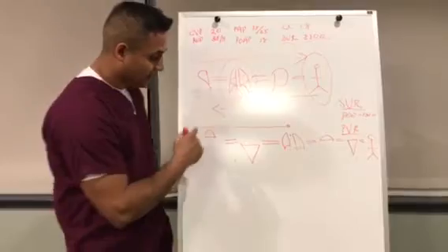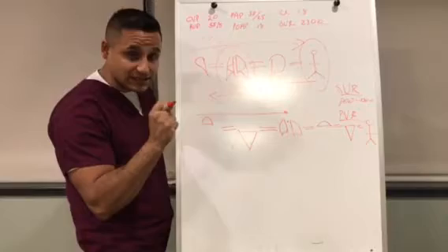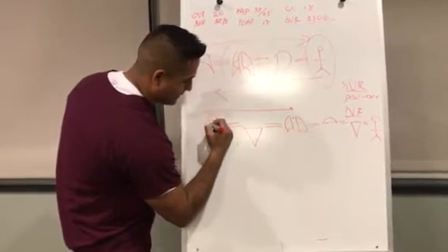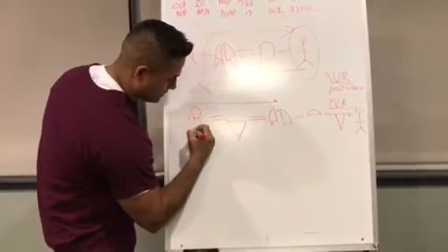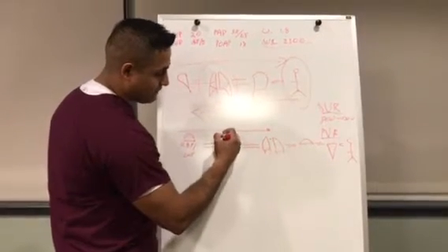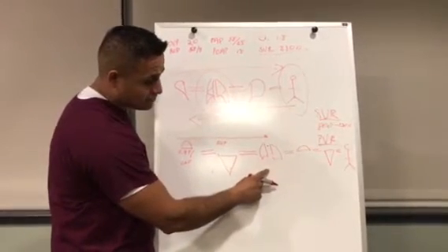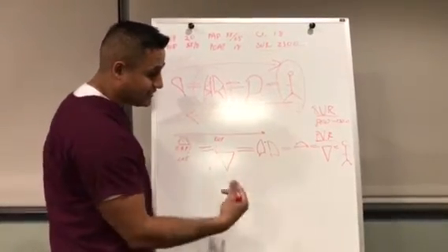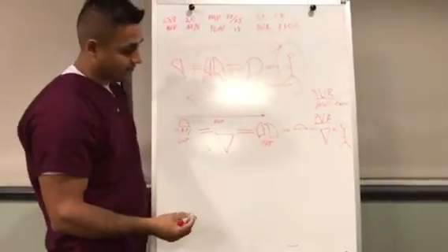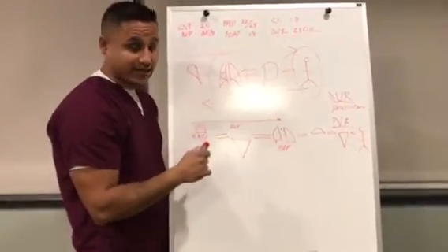So, once the catheter is in, it directly gives us the pressure of the, we're gonna call it right atrial pressure, or CVP. Then it also gives us the pressure that we can find in the right ventricle. And it gives us the pressure that is exerted in the pulmonary artery, okay? Now, that's directly. We can directly measure these pressures with the Swan cath.